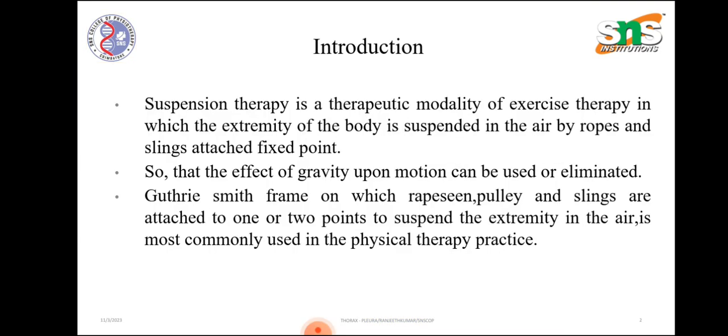First, we'll see the introduction. Suspension therapy is a therapeutic modality of exercise therapy in which the extremity of the body is suspended in the air by ropes and slings attached to a fixed point, so that the effect of gravity upon the motion can be used or eliminated. The Guthrie Smith frame, on which a rope, pulley and slings are attached to one or two points to suspend the extremity, is most commonly used in physical therapy practice.